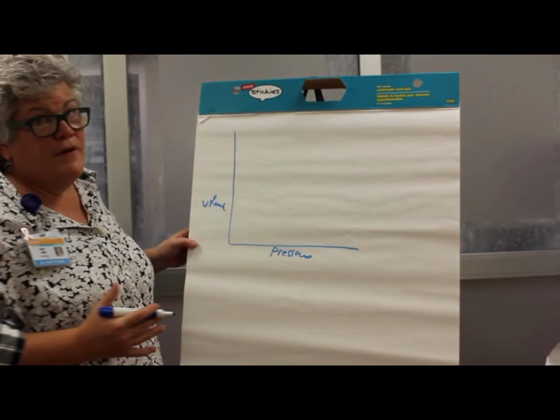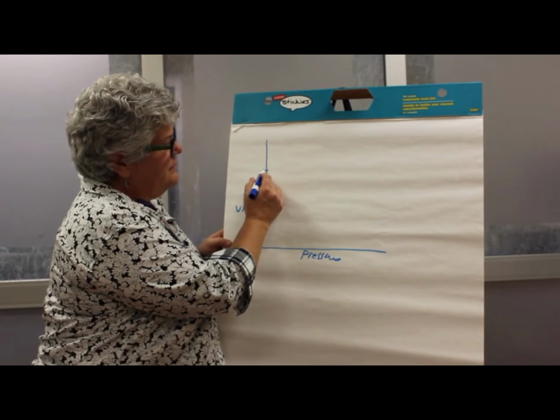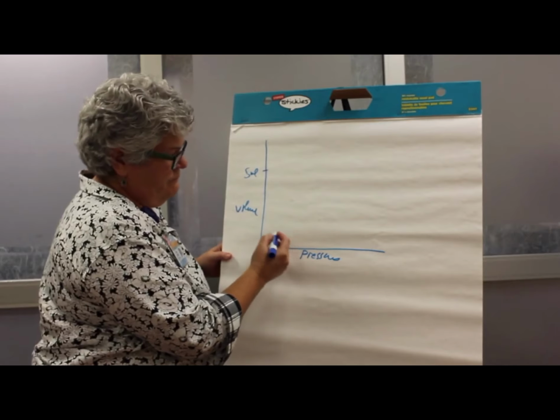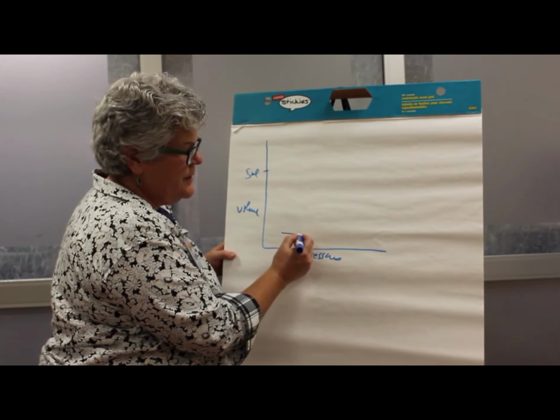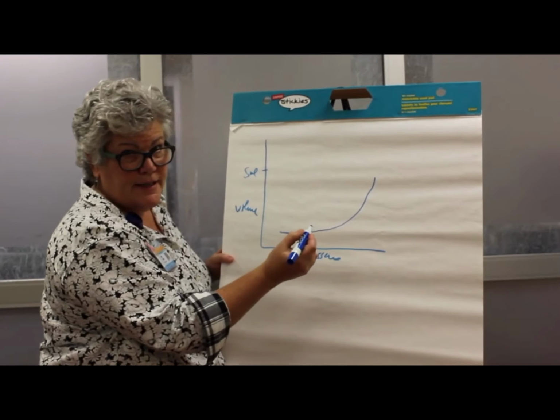So if I'm using volume guarantee, let's say it's a 1 kilo baby, I set the volume for about 5. So the peak amount of volume is going to be about right here. Let's say this is 5 mLs. So I start down here at, I don't know what volume, close to 0. And as the pressure increases, I don't see much change in the lung. Then I reach a certain point and that volume really goes up, like this.